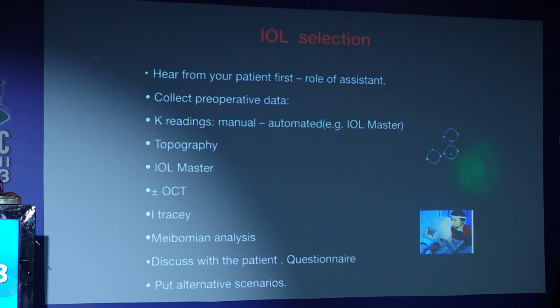And when I go for presbyopic correcting IOLs, I think it is limited to basically EDOFs. EDOFs are for those patients who either have a bad macula, glaucomatous patients, hypercritical patients, or patients demanding night driving, abnormal size of pupils, and uveitic patients. I think these are great candidates for EDOF lenses. The second subset would be those patients who desire good distance, near and intermediate, and these are candidates for the trifocal lenses.